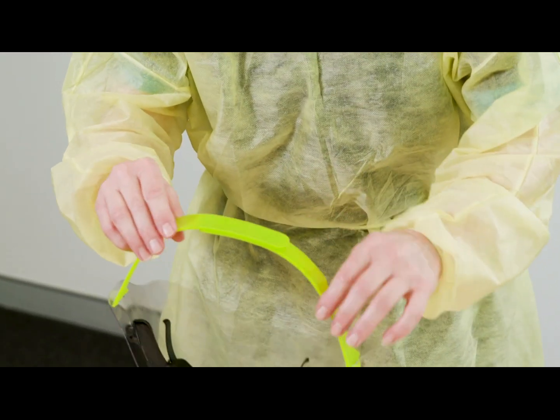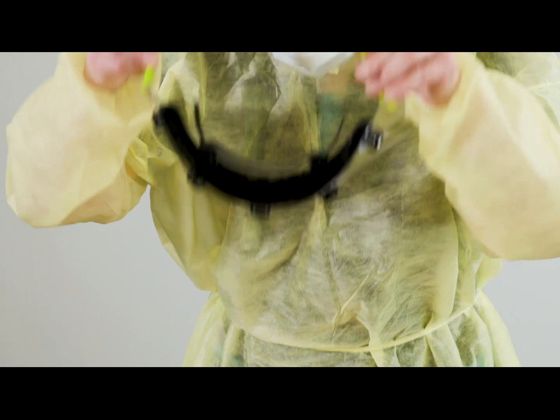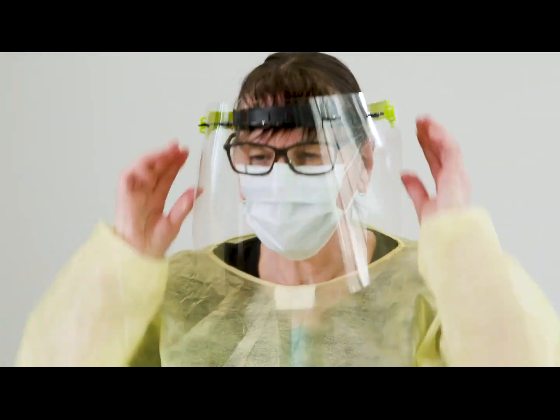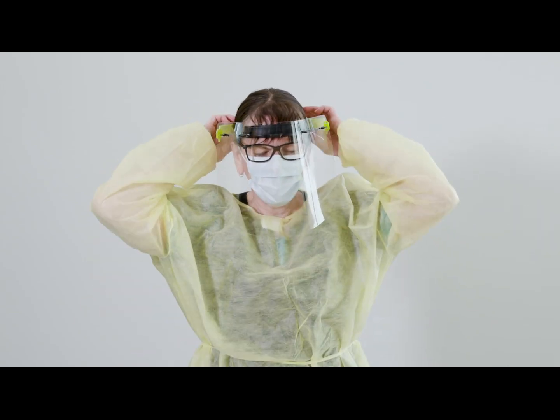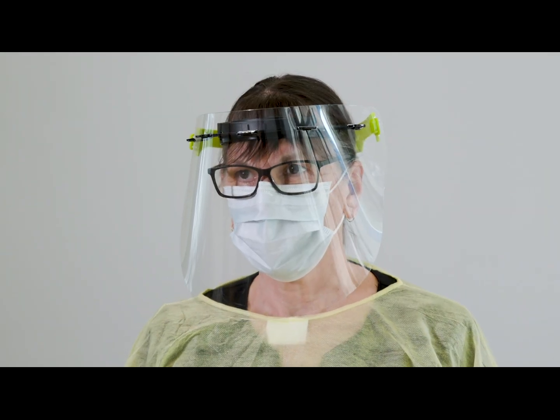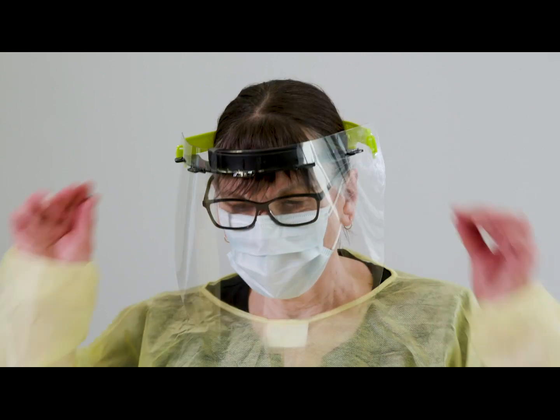To put on a reusable face shield, bend forward slightly, holding onto the straps, and place them around the back of your head. If your shield does not stay in position, tighten by adjusting the straps on the face shield. Do not touch the front of the face shield. Once the shield is on, check that the front and sides of your face are covered.